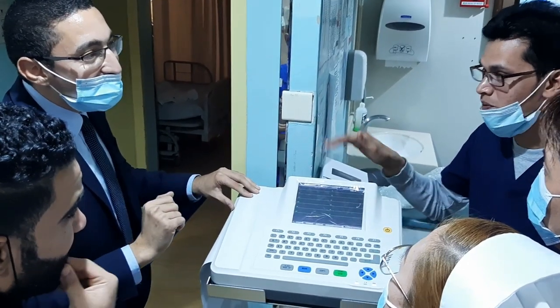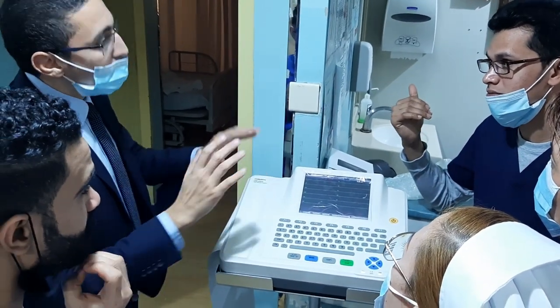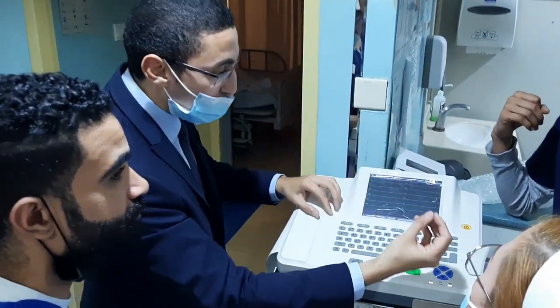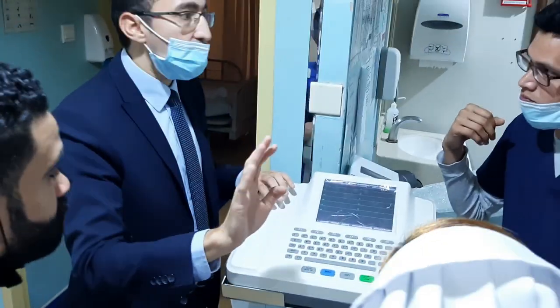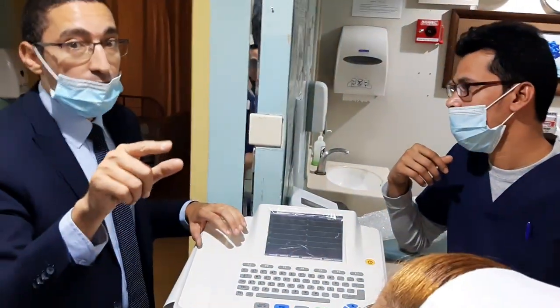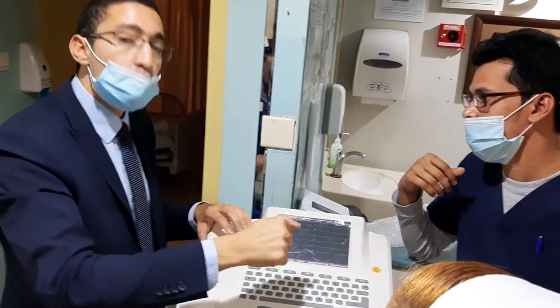After 1000, the previous ones will be erased, replaced by the last 1000. Automatically, okay. But actually it's not automatic. It will give you a memory full message. Not automatic, you will erase. I will show you how to erase.